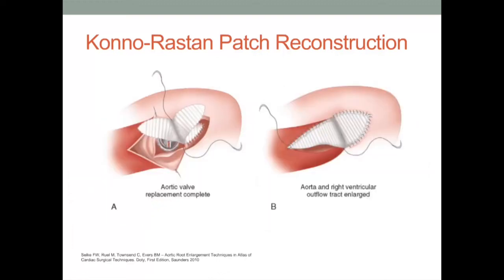The right ventricular outflow tract patch is now folded over the free wall of the right ventricle, and a continuous suture is employed to attach the patch to the ventricular epicardial muscle. The left ventricular outflow tract patch is tailored close to the defect and may be done in a fashion to also incorporate closure of the aortotomy.